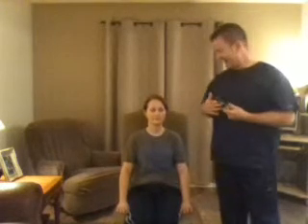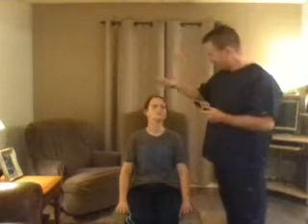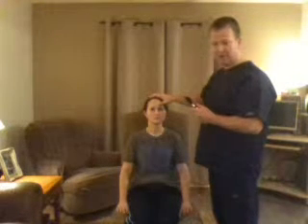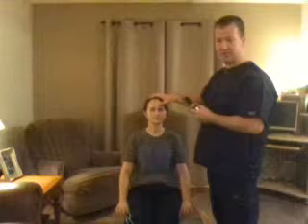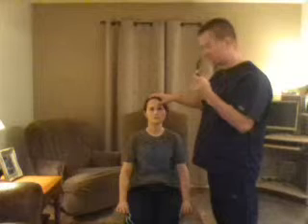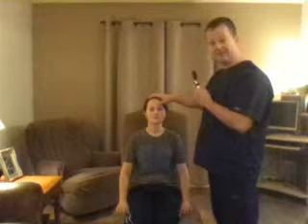Perfect. At this point, we would start our fundoscopic evaluation using our ophthalmoscope. When you're utilizing the ophthalmoscope, you want to make sure that you use the same hand as the eye. So if I'm starting here with the left eye, I would hold the ophthalmoscope in my left hand, and I would be utilizing my left eye. I'm going to take my other hand and place it on the patient's forehead, putting my thumb near the eyebrow so I can know where the eye is to make sure there's no unintentional bumping into the eye, because this is a close examination. I also like to use my pinky finger to be a guide for the distance I need to be.